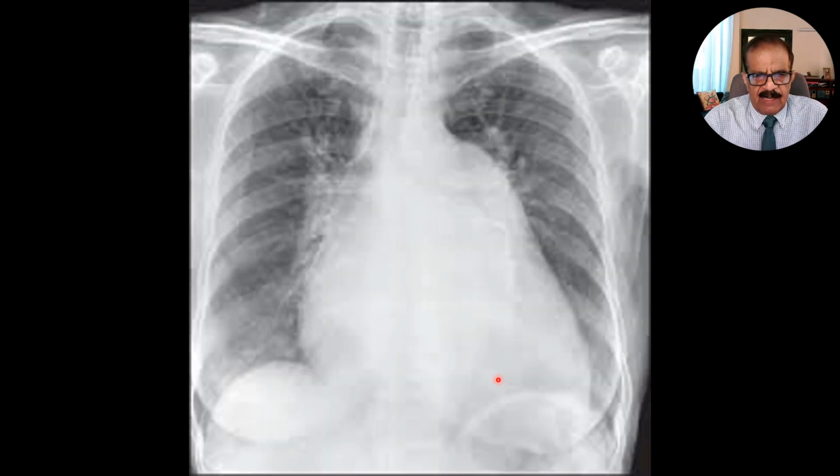The second thing, after size, in this case, if you measure formally, I'm sure you will agree that this is also cardiomegaly, not that much as we saw in the last section, but there is definitely cardiomegaly. And the second thing we want to know about the heart is its silhouette, the shape of the heart. Now, this is not the normal shape, because normally this border should be concave.